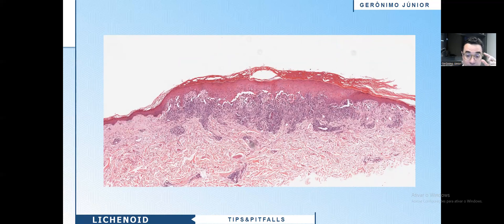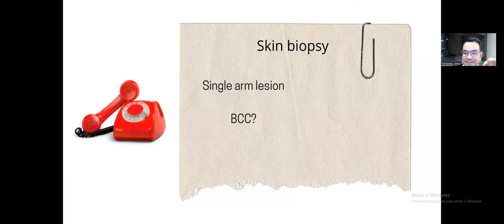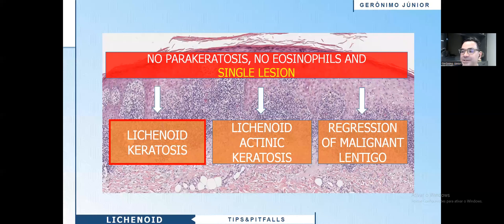Now see this case. It is a lichenoid infiltrate, similar to the previous case — you might think about lichen planus. But in this case, we see lichenoid infiltrate, subepidermal clefts, and many necrotic keratinocytes. There is an important clinical detail: single arm lesion, with the clinician considering basal cell carcinoma. If you don't have this clinical information, you need to ask for it — call the dermatologist. This case is an example of lichenoid keratosis.